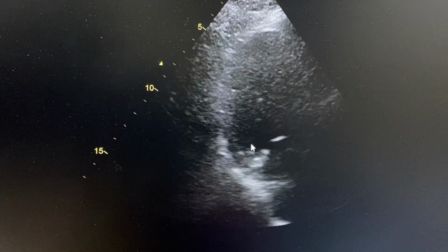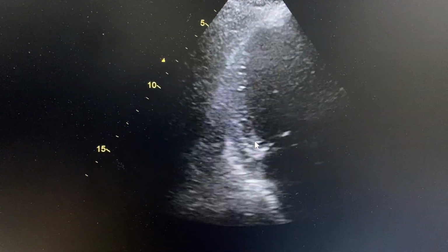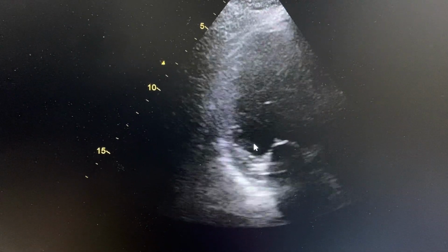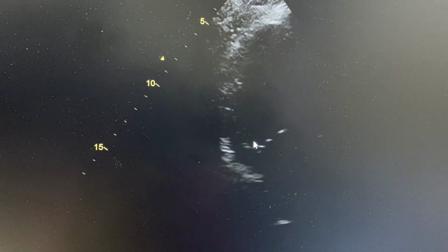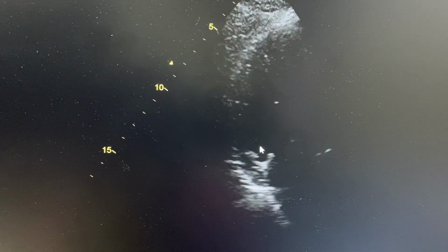You see the tips of the anterior mitral leaflet and posterior mitral leaflet. Check the tip of the anterior mitral leaflet. It is bright, and if I try to reduce the gain, it continues. Other structures disappear, but this remains, meaning that is calcium. And also the annulus, the posterior wall, has some mild annular calcification.